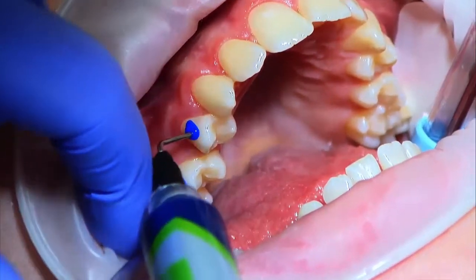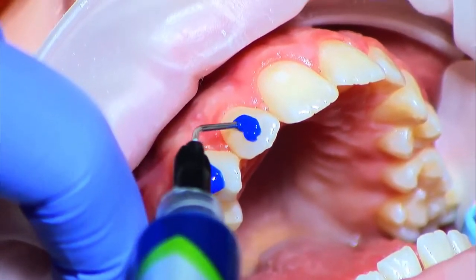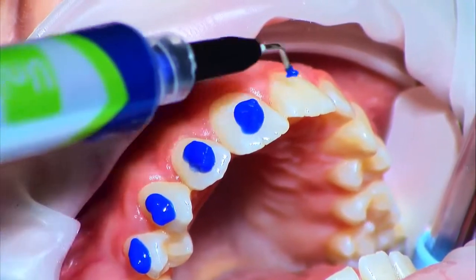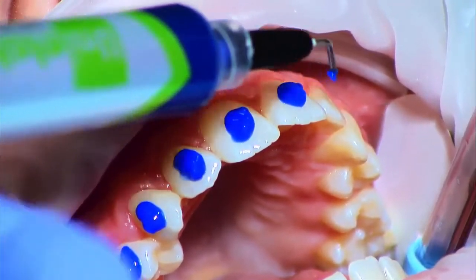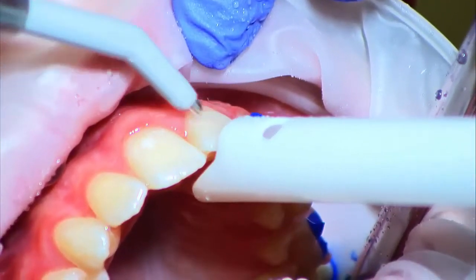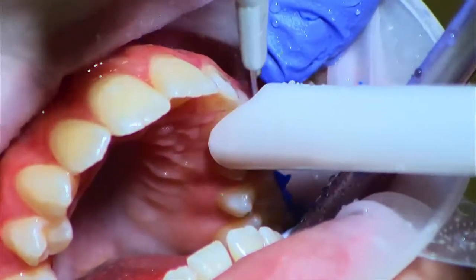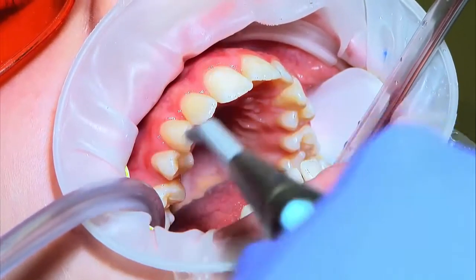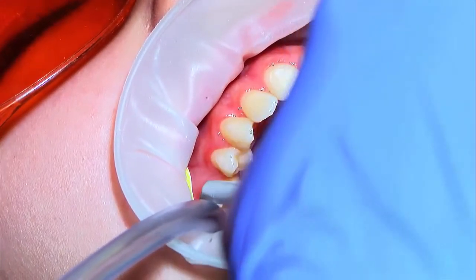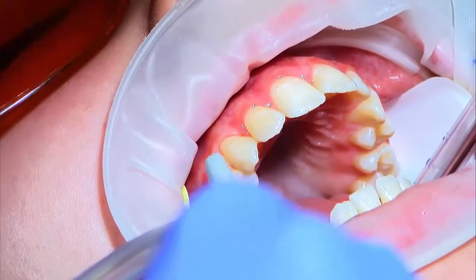Once dry, the teeth should be etched with phosphoric acid. This process should not take more than 40 seconds, so it is important to move fast, making sure that the central part of each tooth is covered. When completed, rinse with water for 10 seconds per tooth. Then use suction and the warm air tooth dryer to remove as much moisture as possible and obtain the desired frosty surface on the teeth.